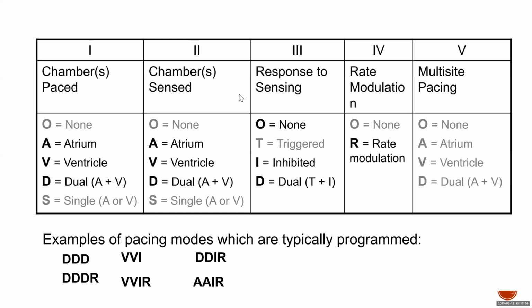Yeah. But what about the T? It means we trigger the atrium, trigger the ventricle, similar to the physiological one. Exactly. Trigger. So there's also a question from Nasser to repeat the trigger.